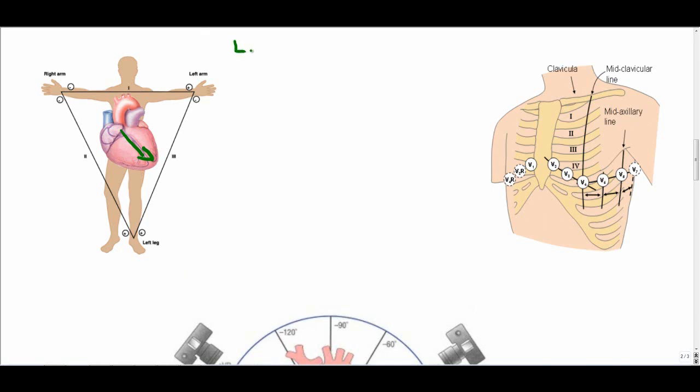The first thing to look at is the limb leads. Limb leads are essential for an EKG. They help us understand the main direction of depolarization in the heart and they tell us a whole host of information that we need to know in diagnosing heart pathology.